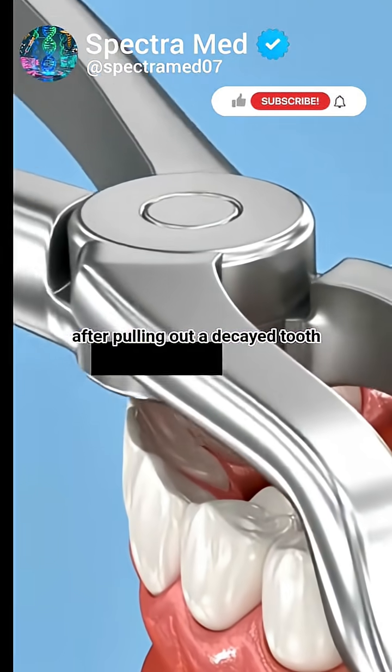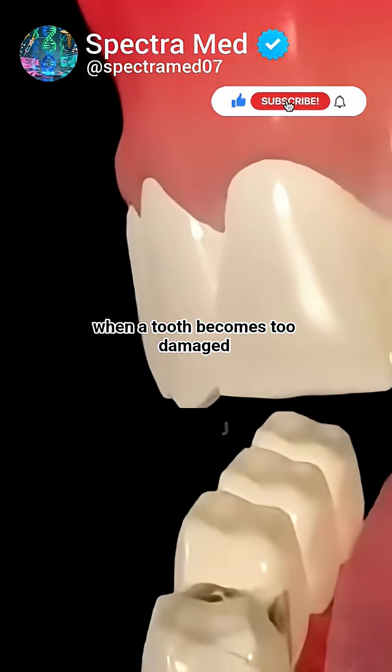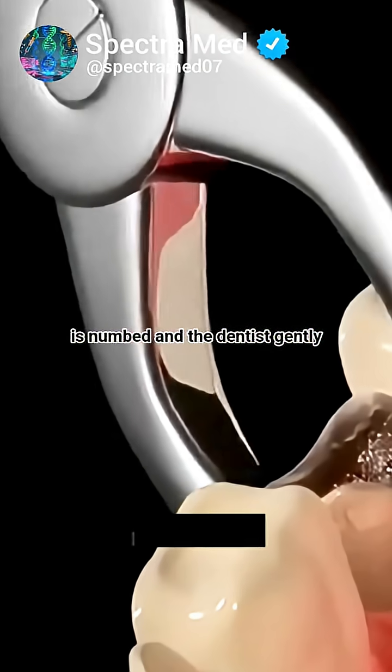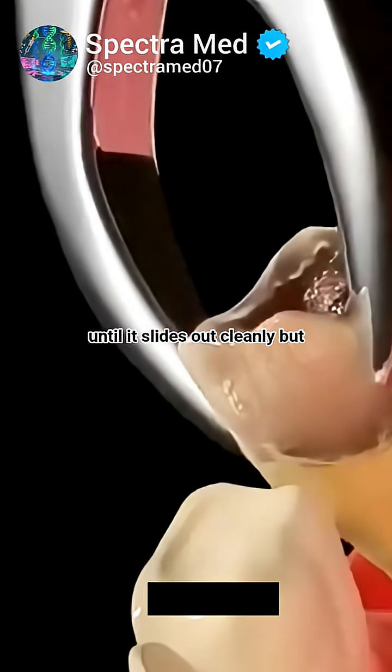This is what doctors really do after pulling out a decayed tooth. When a tooth becomes too damaged to save, the only option is extraction, removing it completely. The area is numbed, and the dentist gently loosens the tooth using special instruments until it slides out cleanly.